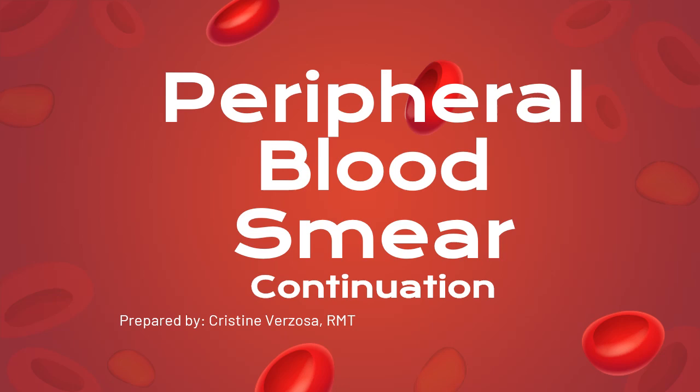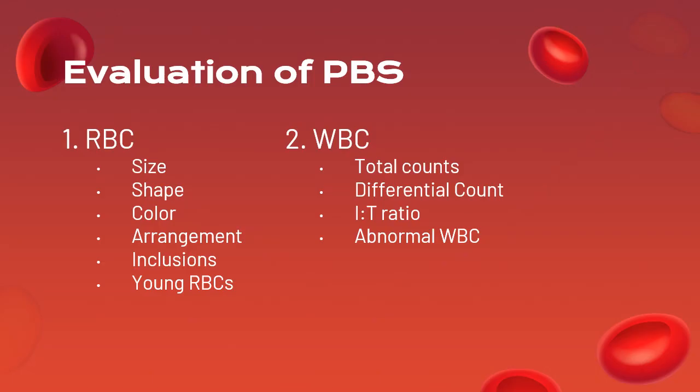Okay, so part 2 regarding PBS. So, evaluation of PBS. So, this means ano ba yung mga factors na tinitingnan natin using the blood smear.